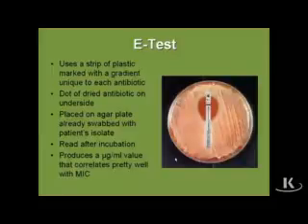Now, clinically, when are you going to use the MBC? You're going to use the MBC when you've got somebody that's immune compromised and can't fight for themselves, okay? So in order to treat some bacterial infections in immune compromised patients, that's when the MBC is going to be valuable. Now, the last test I want to talk to you about is the E-test.